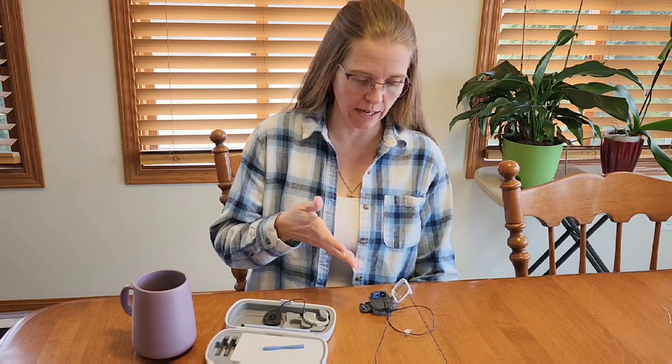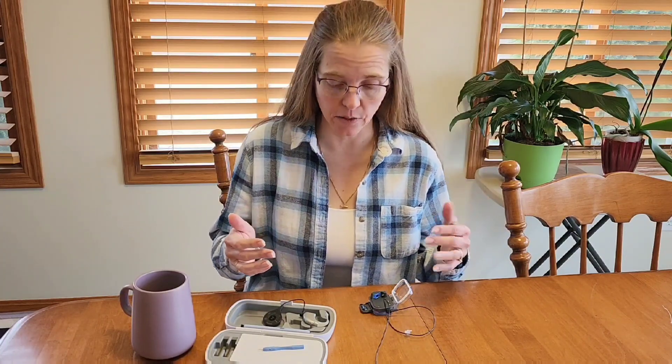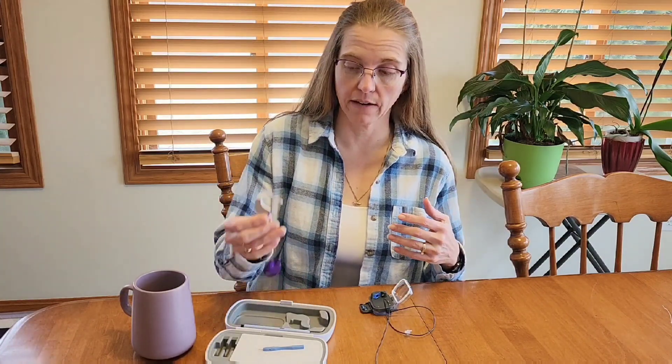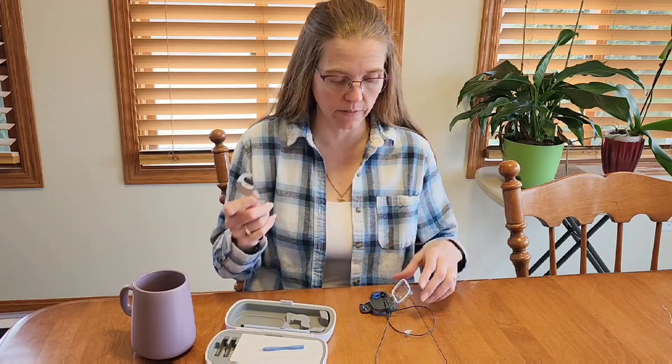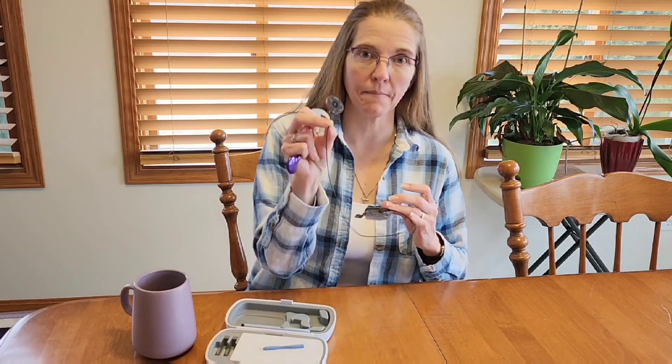Hey everybody, it's Rachel here with Two Ears Are Better Than One. In today's video, I'm going to show you how to assemble your mWaterproof battery — it's actually very quick and easy to do. To do this, you need to have your processor with the battery removed and have the mWaterproof battery with the SlimHP Aqua mic.